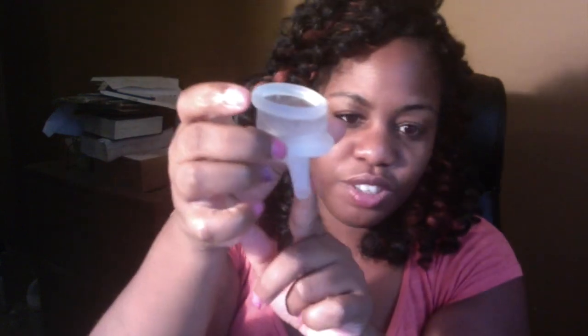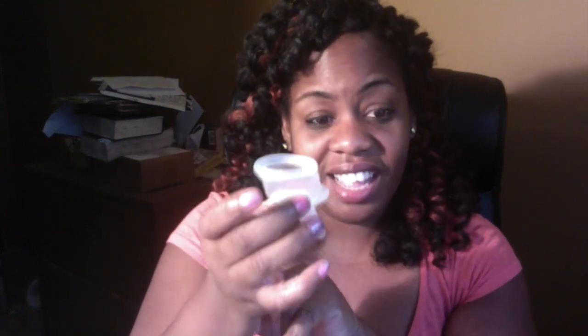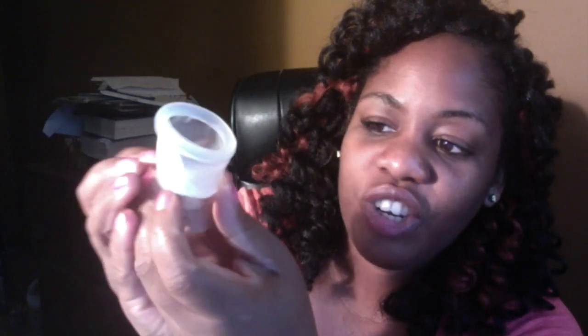This is the condom. And I guess this is where your specimen will be, right here at the tip. So the one thing that we did not do is that my husband did not wear the condom. Basically, he did the pull-out method and just deposited it in here. Within the condom, there is a little circular thing, a little container that's in here. And I'm going to take it off. So once you're done and your specimen is already in here, carefully, so you don't spill anything, you roll and try to get this part out of here.